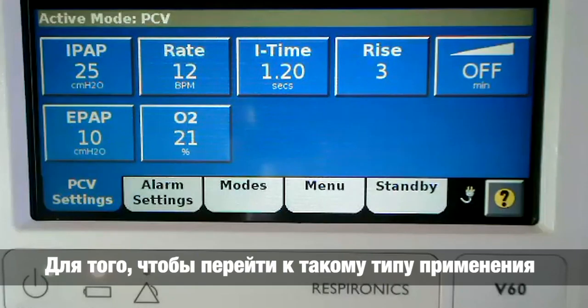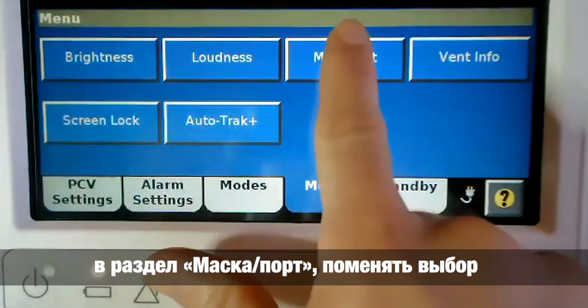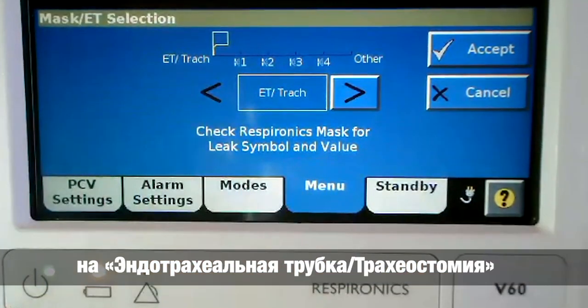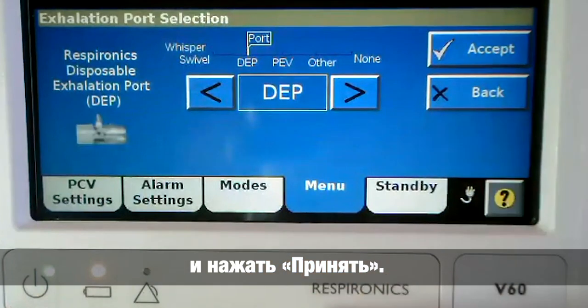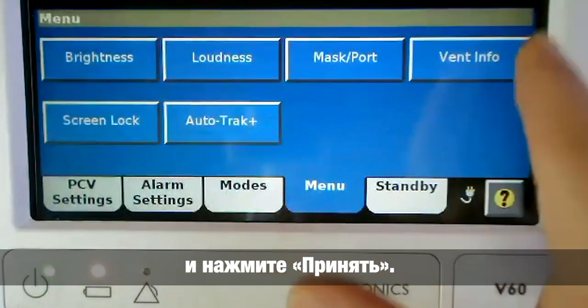In order to do this on the V60 Ventilator, you need to go to the Menu tab, Mask Port, change your selection to ET Tube Trach, and Accept. Then choose the correct exhalation port and Accept.